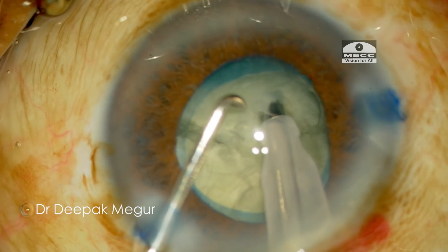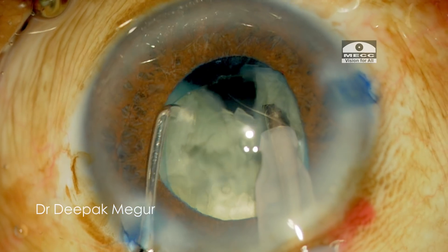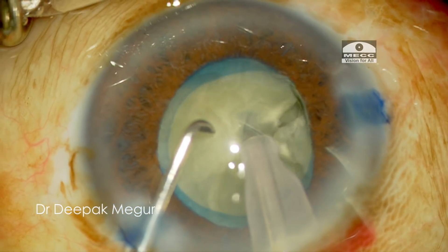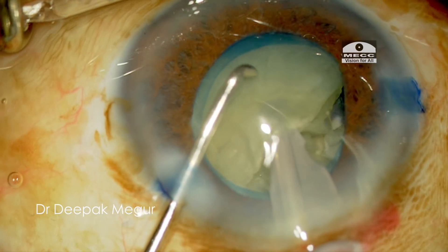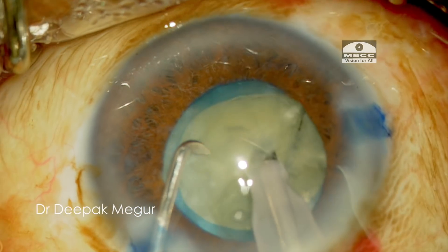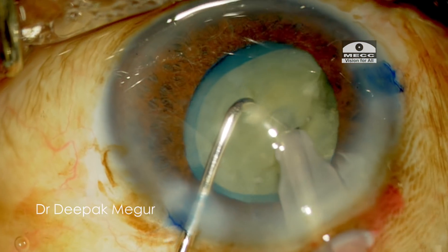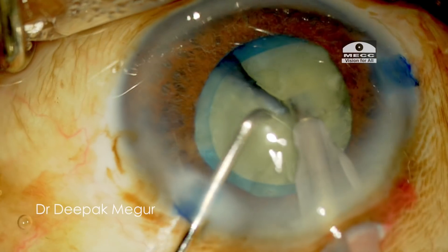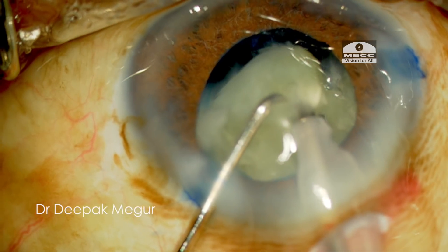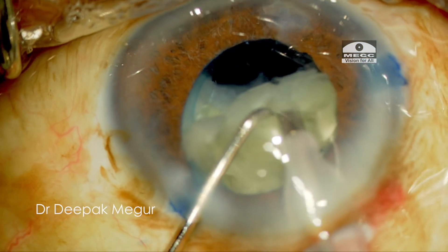This process of vertical chopping is continued until we get around six fragments. Once the individual fragments are chopped, I don't phaco them immediately — I want them to stay in the bag so they can form the bag and support it. This technique is especially useful when dealing with a mature cataract where the bag becomes empty as soon as fragments are aspirated, due to the lack of epinucleus or cortex.